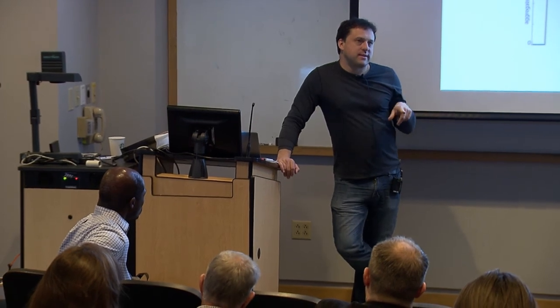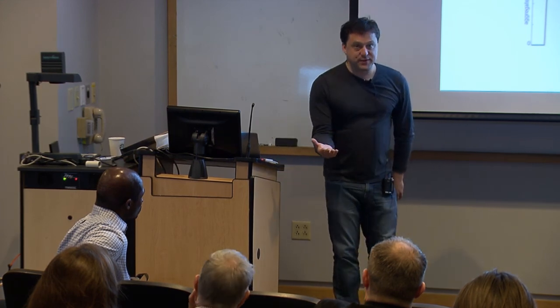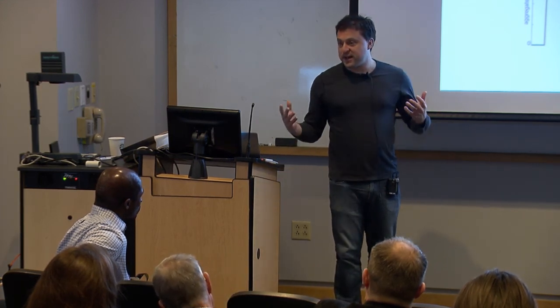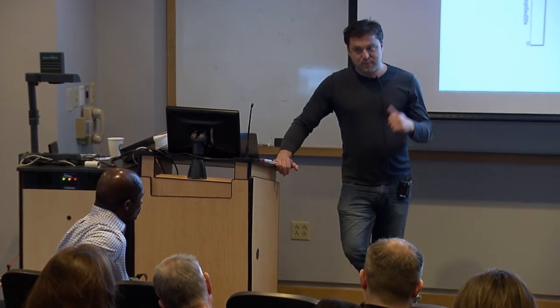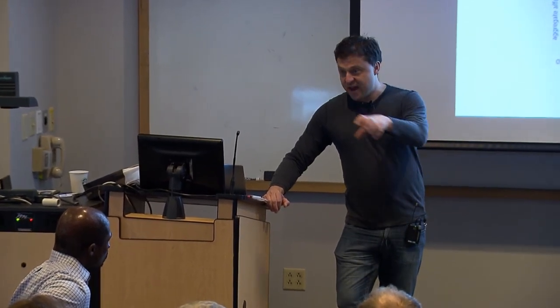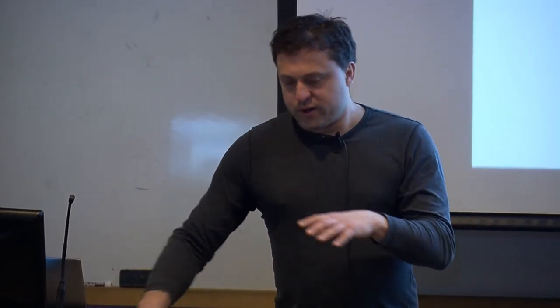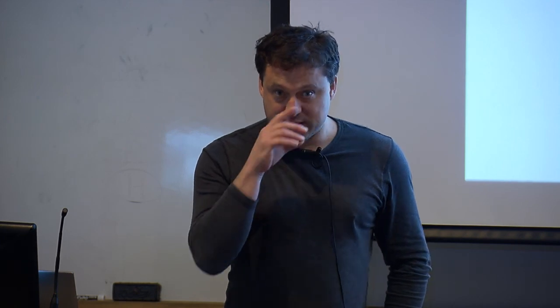Right. So we're working on that. But here's a very good question. Everything we do is like the animal sitting there. Is this applicable to any kind of active touch paradigm? Here's why I think yes: when we take all the ideas that were developed using passive paradigms and apply them to this ARAT task, where the human subject is doing things, we see an improvement in performance, right? So it seems to work. But in my lab now, we're starting to create environments where monkeys are interacting with virtual objects. We're tracking their hands, and they interact with virtual objects and get tactile feedback from these virtual objects through ICMS, and then we'll be able to test that more.